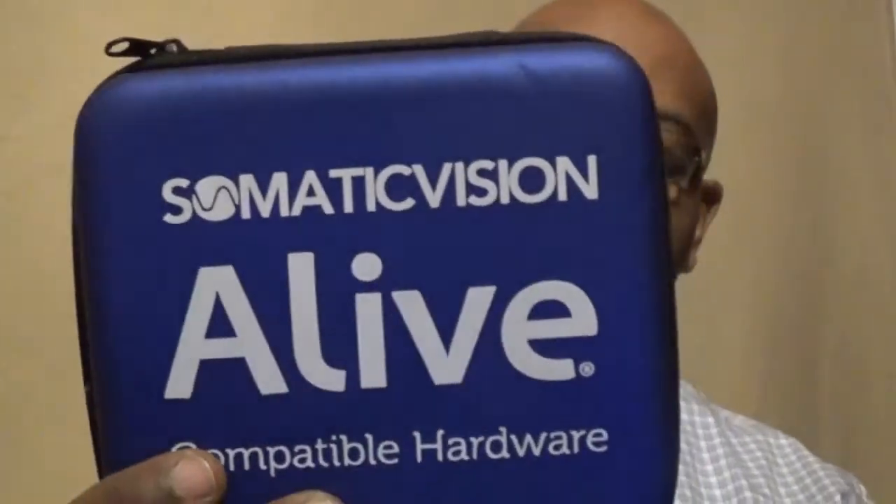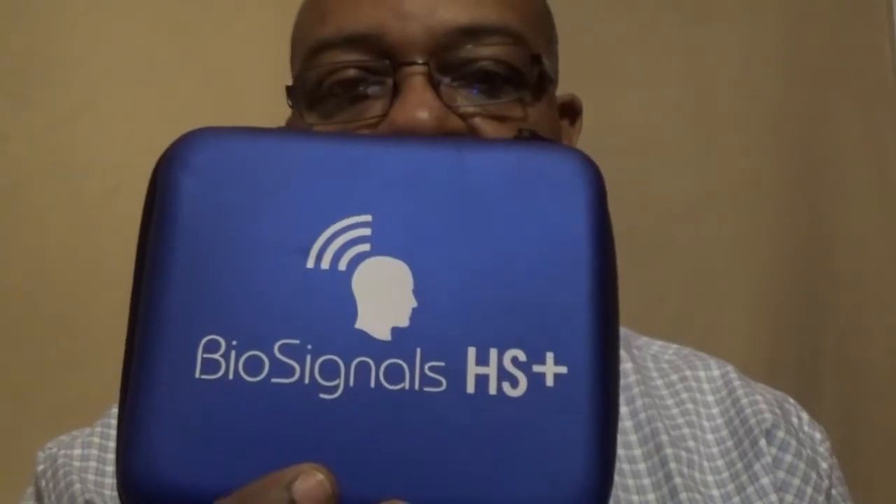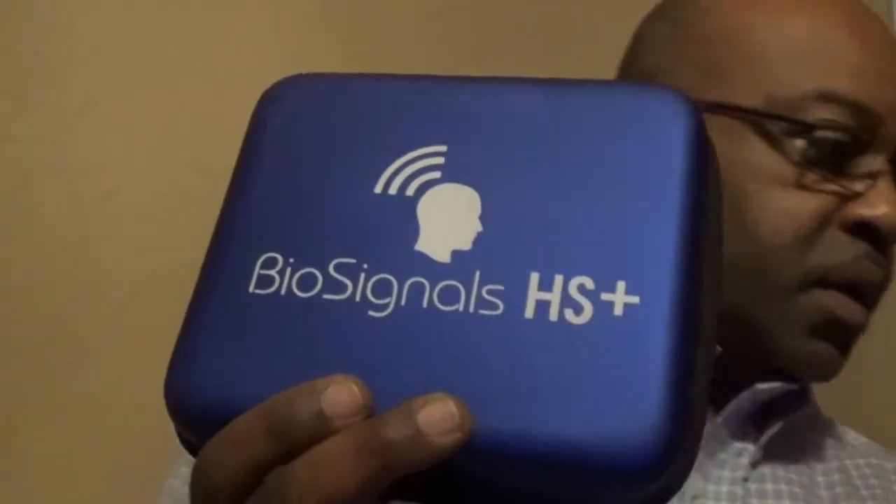Hi, this is Harry from Biofeedback Resources International. I wanted to show you a little bit about this Alive system. This is the Somatic Vision Alive software with this new hardware kit. It's called the Biosignals HS Plus. There's a smaller version of it here, which is the Biosignals HS, and I'll tell you the difference.